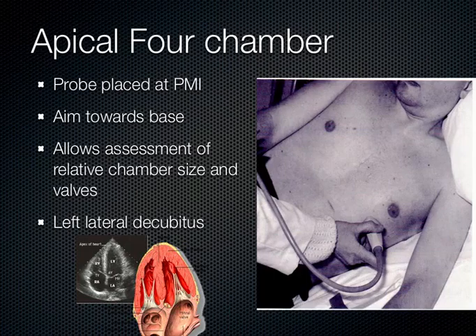Now patients who have chronic obstructive pulmonary disease or who smoke a lot, they lose that PMI, it goes away because their lungs expand to fill that little space. And so this is a very difficult window to obtain in patients who smoke or have chronic obstructive pulmonary disease or COPD. But this next week with your models, you'll see none of them do that. So they all have really good PMIs. And so this is a pretty easy window to get, hopefully next week.